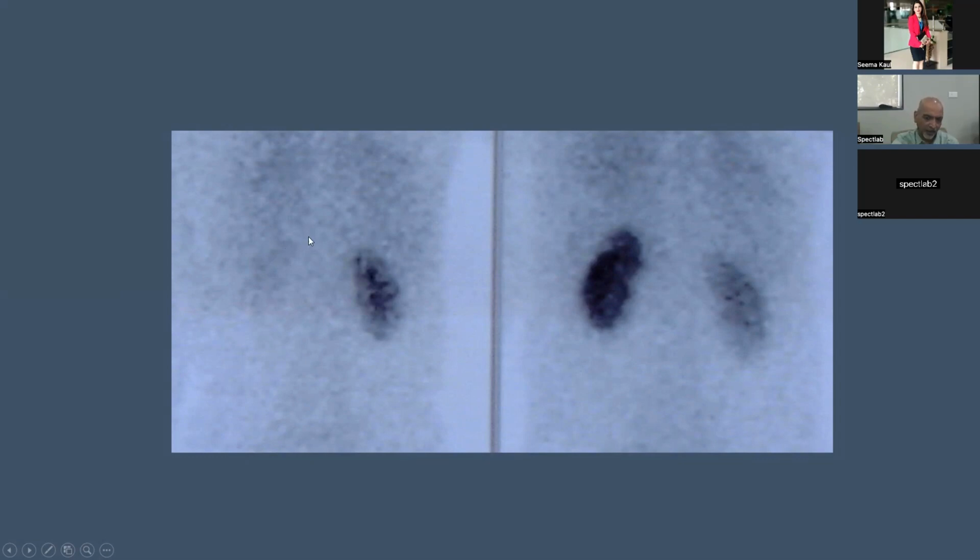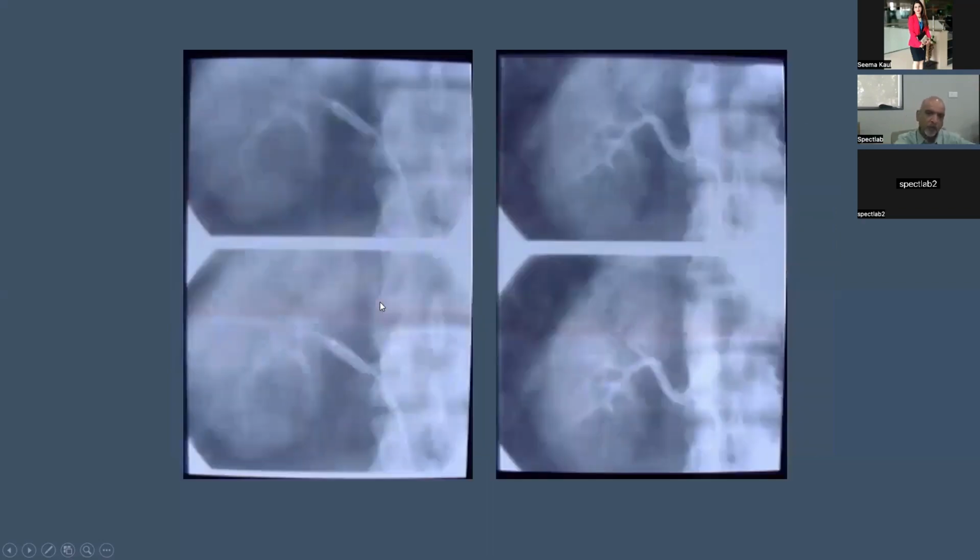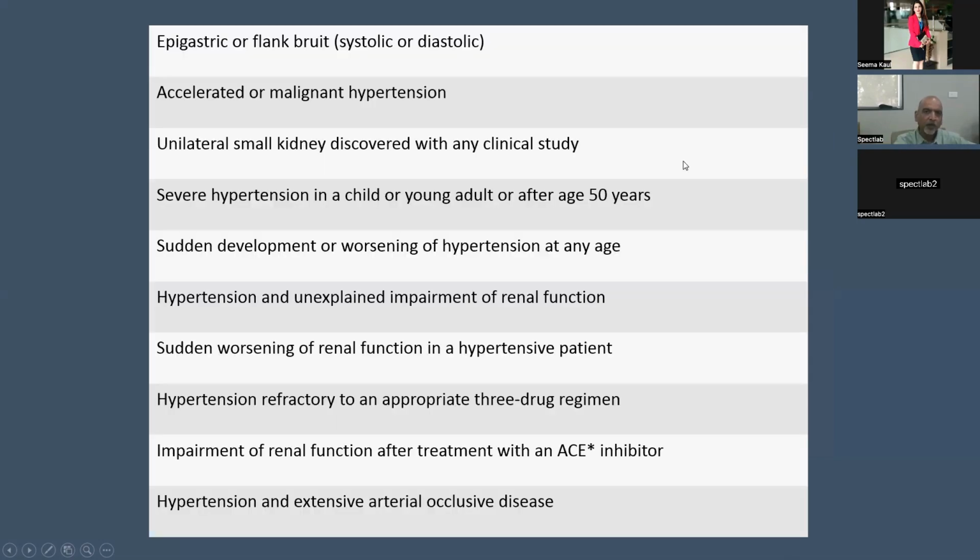the affected artery. And that's how the GFR is maintained, because the post-glomerular arterioles constrict under the influence of angiotensin 2, the effect of which gets eliminated on administration of captopril. And so the filtration pressure, the GFR, falls, and that becomes obvious on the renal scan. And this was, of course, the stenosis seen and effectively treated.